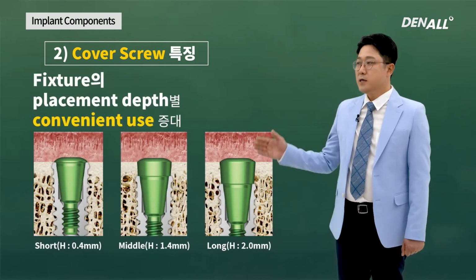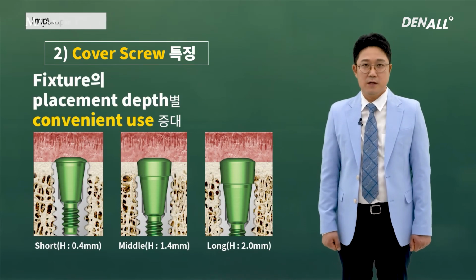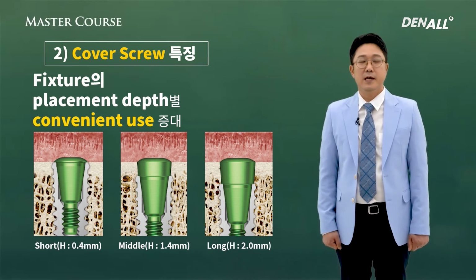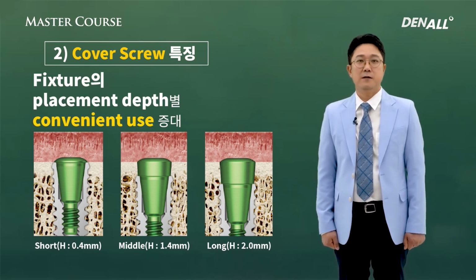There are three types of length for cover screw, and depending on fixture placement depths, you can use it accordingly. Details on this can be found in one-stage, two-stage surgery lecture or offline master course.